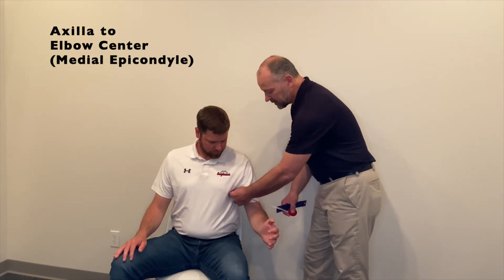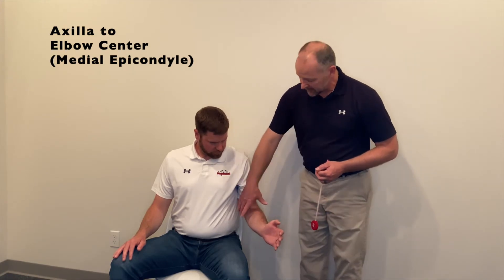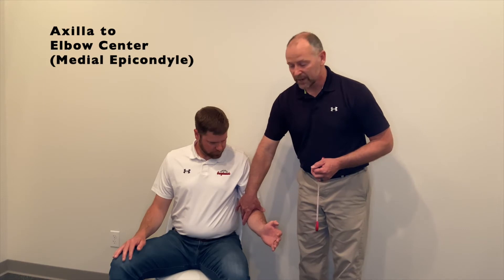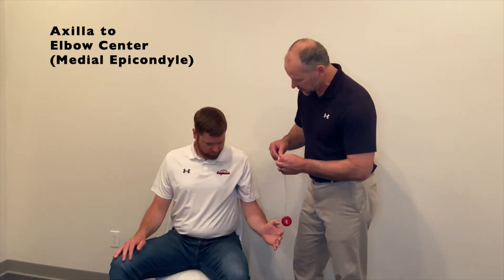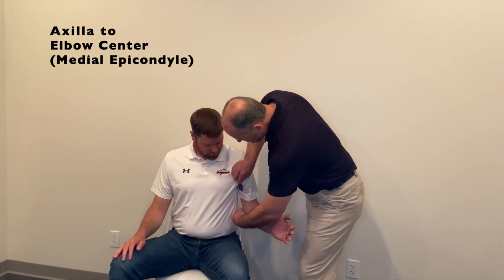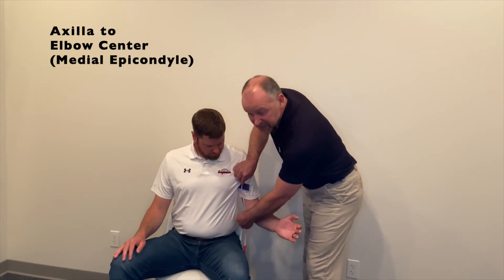Rather than trying to place the end of your tape measure up under the arm to capture that initial endpoint, we recommend that you use some type of firm straight edge that you'll simply lift up under the arm and bring it up to its stopping point. We're not going to apply any pressure to displace or compress soft tissue, but simply bring it up to its stopping point. Have the patient hold that in place, then measure from the top edge of the ruler down to the elbow center — the medial epicondyle — along the midline of the upper arm on the medial surface. In this case I get six and three quarter inches.